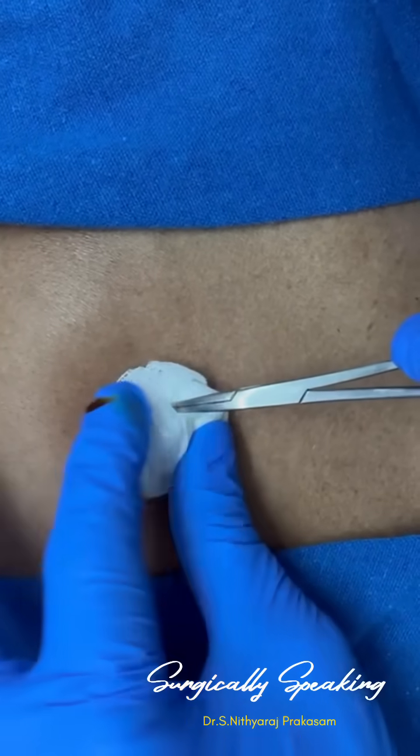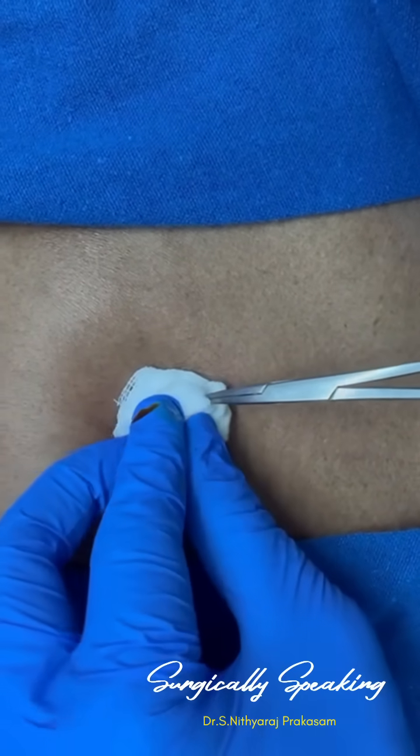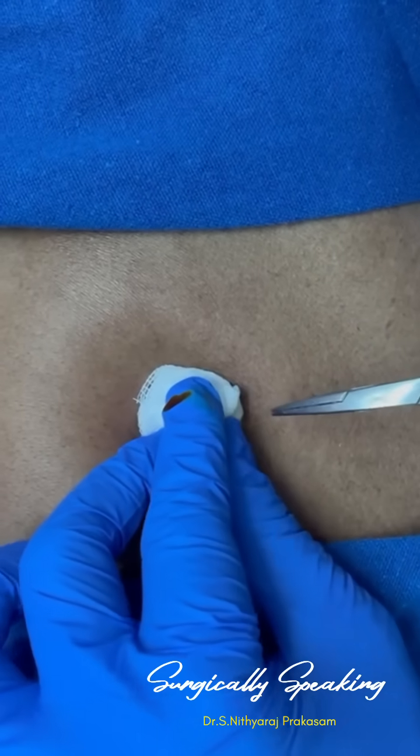So that's how I do it. That's how I give local anesthesia and do an incision and drainage for an infected sebaceous cyst.